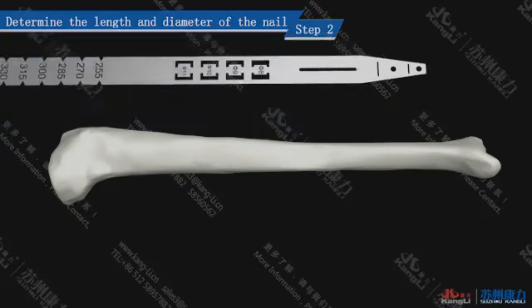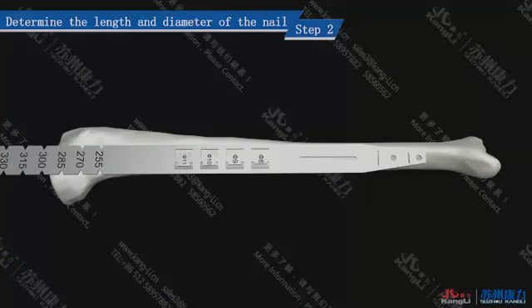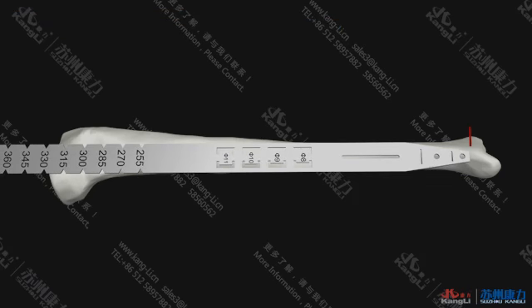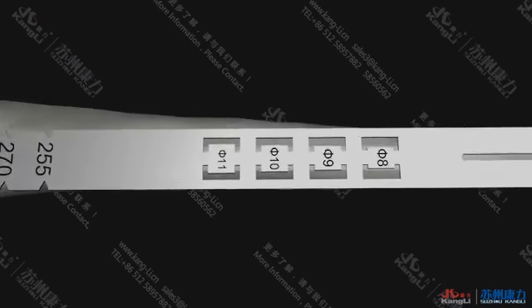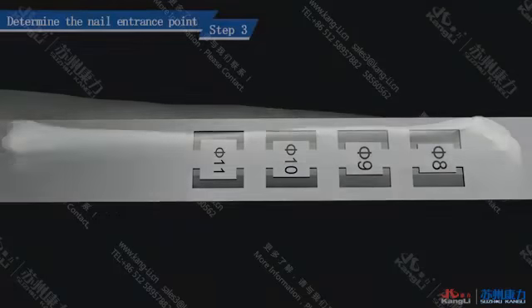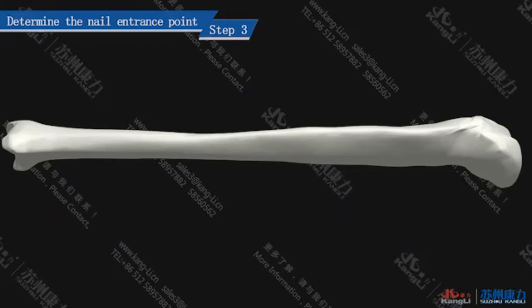Step 2. Determine the length and diameter of the nail. Length selection. Place the developing gauge by the side of the tibia, with the proximal side at the nail entrance point and the distal side at the tibial dome. Then directly read out the length. Diameter selection. Place the developing gauge right in front of the tibia and predict the diameter by readings on the developing gauge.